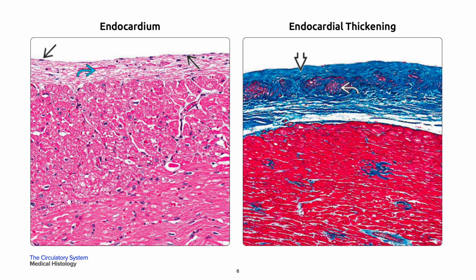On your right, thickened endocardium is seen normally in the left atrium and subvalvular portions of the ventricles. There is also increased collagen fibrosis in a bold black arrow and elastic tissue. The endocardium also contains a thin smooth muscle layer throughout much of the heart, which is in a white single curved arrow.